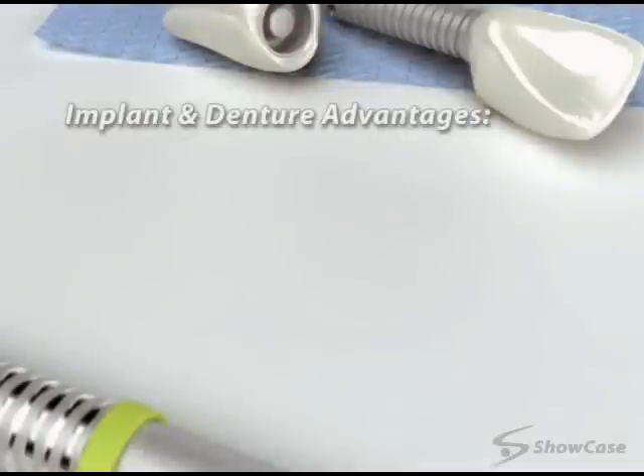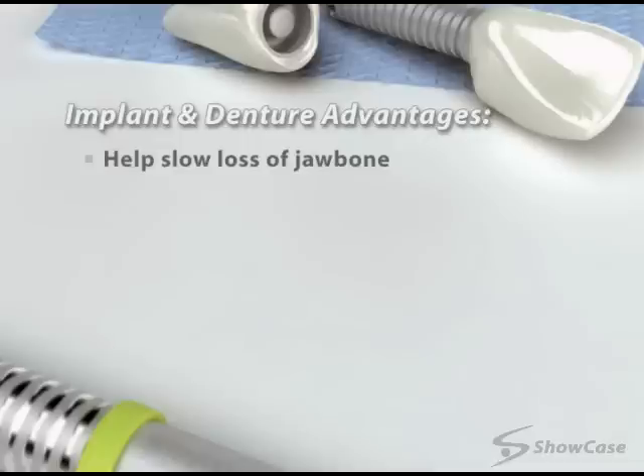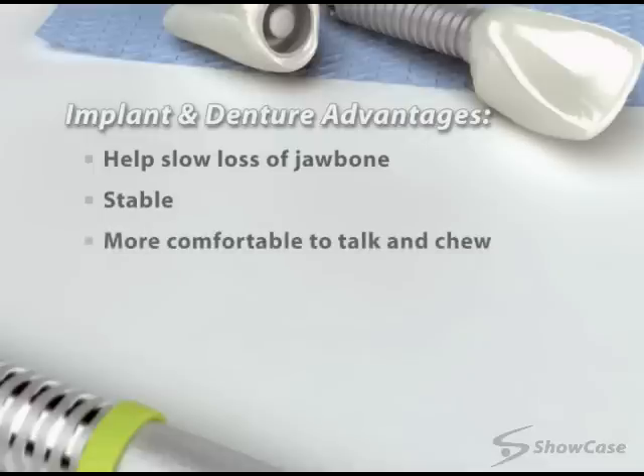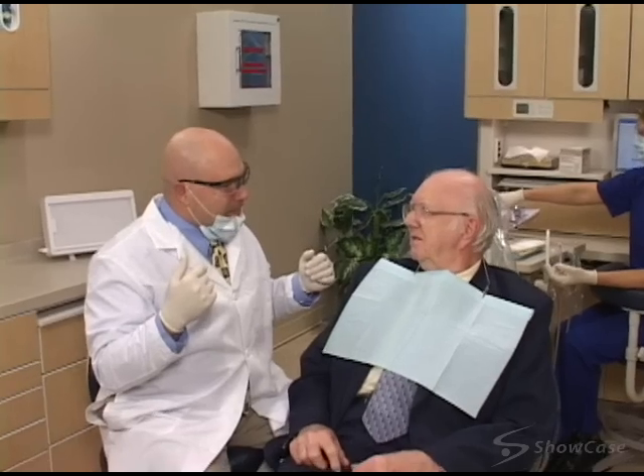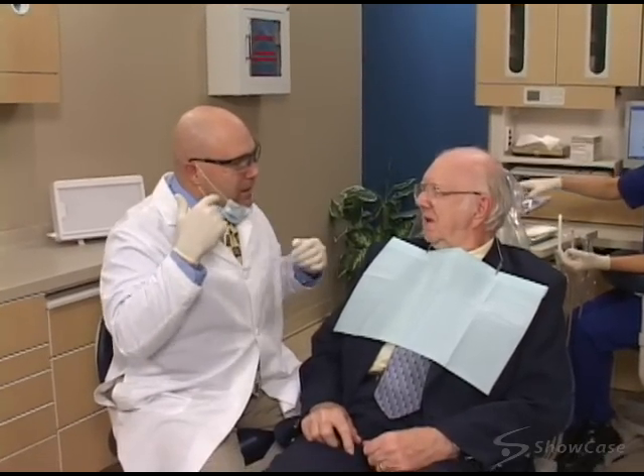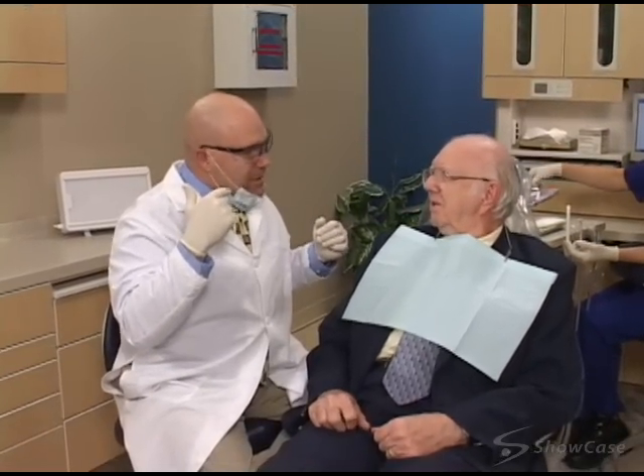Dentures attached to implants have several advantages. The implants slow or stop the loss of jawbone that occurs when teeth are missing. The dentures are stable in the mouth, which makes it more comfortable to talk and chew. And the dentures are removable for easier cleaning and checkups. With proper home care and regular checkups, your implant-retained denture can provide a secure and natural-looking smile.